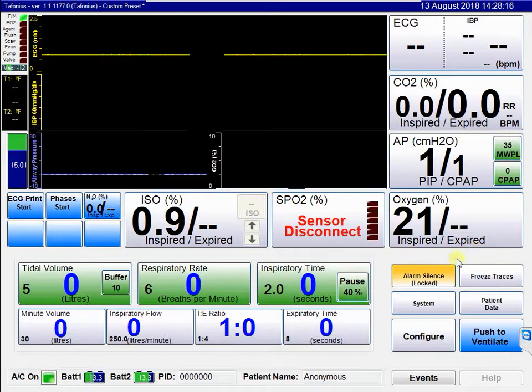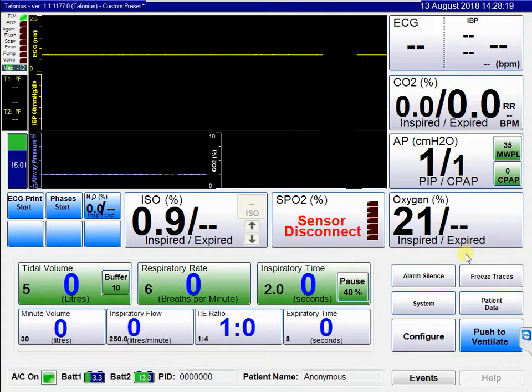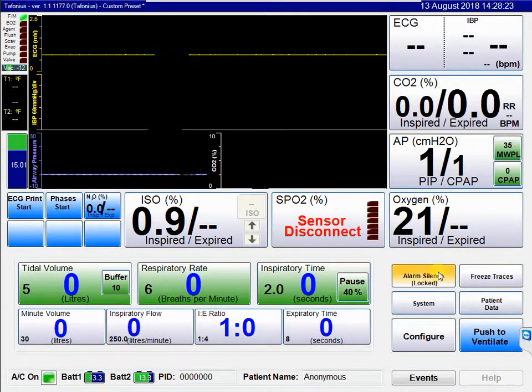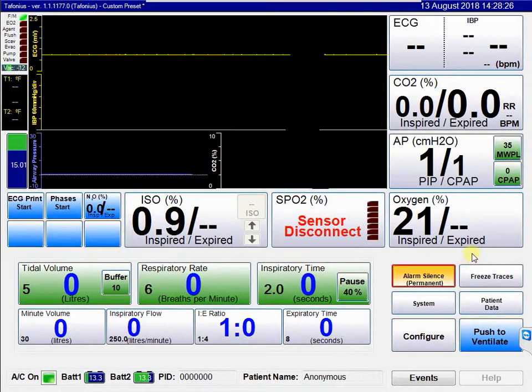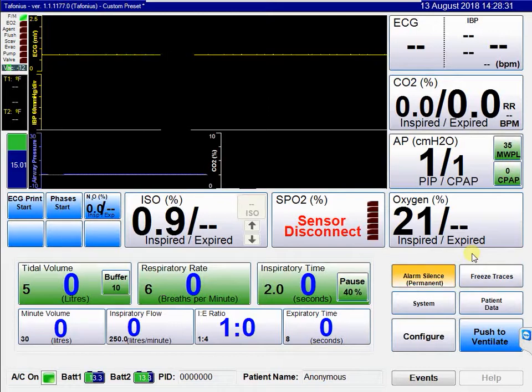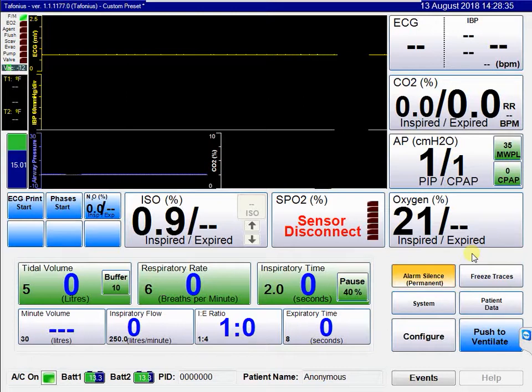The third way to use the alarm silence button is to hold it even longer, and it will say permanent. When in a permanent state, it flashes to indicate that all alarms are silenced for all conditions — there will be no alarm noise at all for any condition whatsoever. To cancel any of these states, simply click on the alarm button.